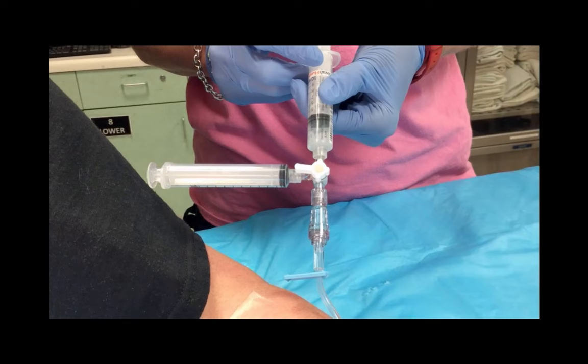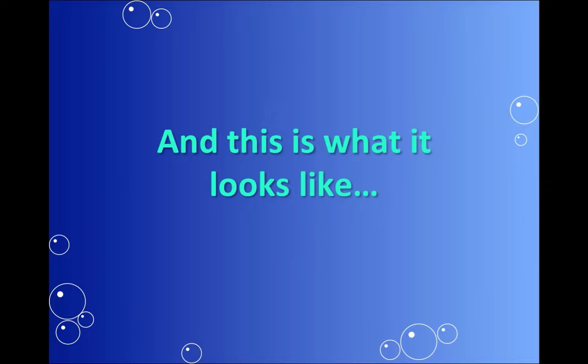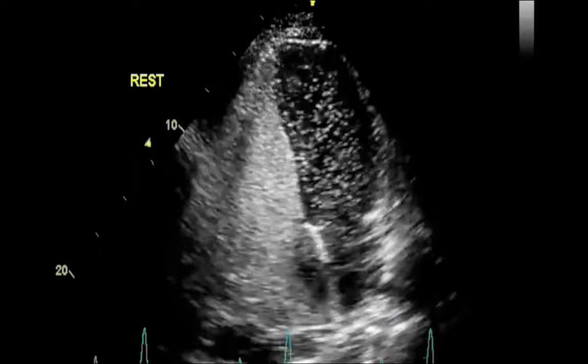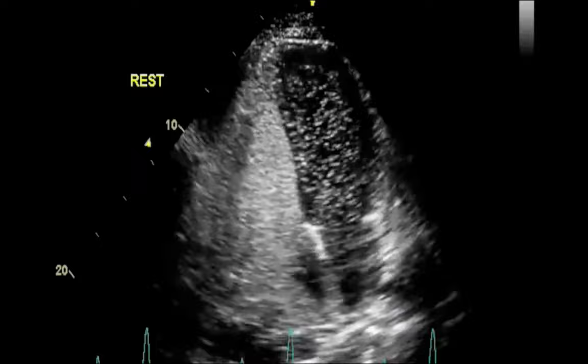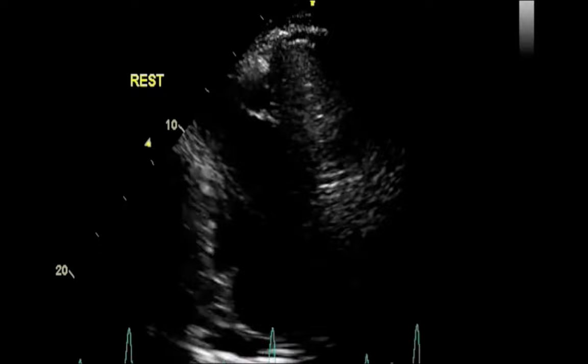The registered cardiac sonographer will instruct the patient to Valsalva or cough. As the saline is being injected, this is what it's going to look like on the echo screen. Looking at the bottom left hand corner, you'll see that the air bubbles are being injected into the right side of the heart — they go in through the atria and up to the ventricles. As they leave the right ventricle, they'll go through the pulmonary artery to the lungs, where the bubbles are breathed out. What you shouldn't see is what looks like a hornet's nest on the left side of the heart. Since this patient has bubbles on the left side of the heart, they have a positive bubble study. This patient in particular has an atrial septal defect.